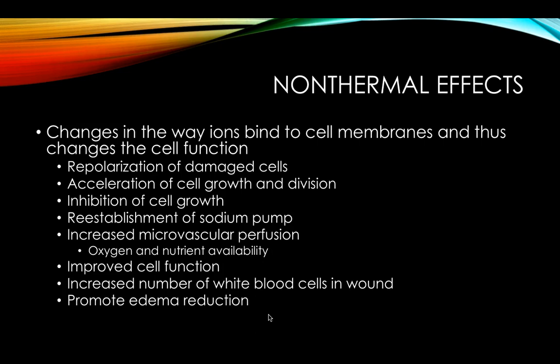The acceleration of cell growth and division, that's especially when it's already happening too slowly because of injury. And then the next step there, right, we get inhibition of cell growth when it's happening too rapidly because of changes in the dynamics. So it can actually help on either spectrum to get us back to more of what would be considered normal.